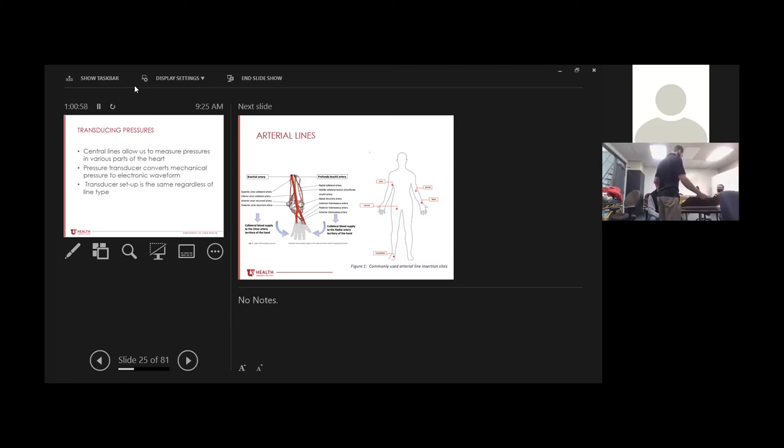These are not pre-primed, is that correct? That's correct. And we are going to talk about how to prime all this stuff, either today, depending on timing, or if not, in the ICU. I'm in the surgical ICU with you guys, and at my station we're going to mock package. We're going to do central lines, transducers, vent, pumps, and we're going to make you mock package the sickest patient in the ICU. That's what's planned for my patient station.